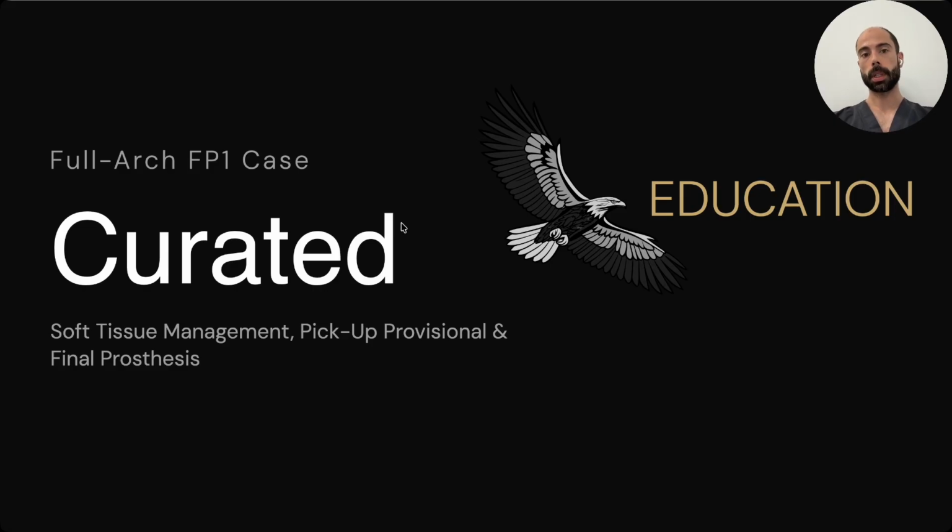And this wraps up our Full-Arch FP1 series, 7 episodes covering everything from initial diagnosis and DSD through guided bone reduction, implant placement, soft tissue management, and final prosthesis delivery. I hope this gave you a complete picture of what it takes to execute a true FP1 case, not just surgically, but biologically and prosthetically.